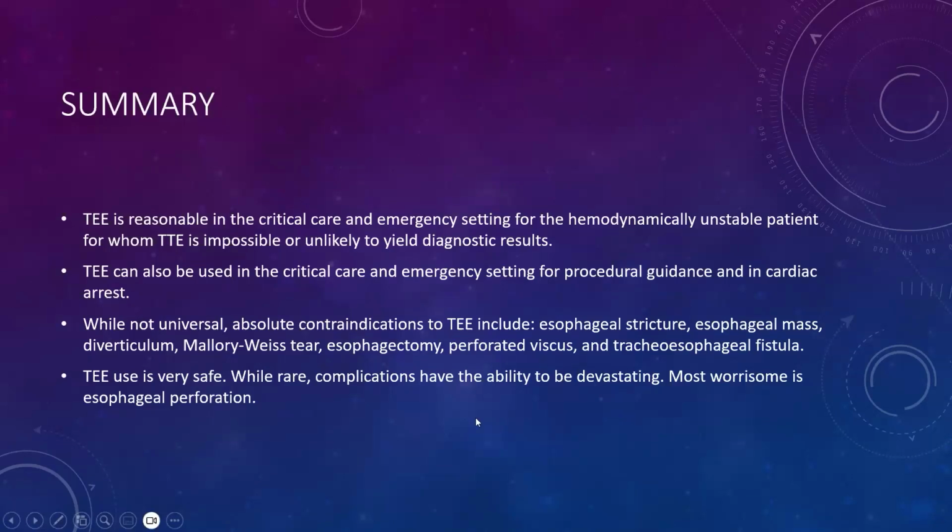There are problems with putting in TEE probes, right? The most devastating complication that we worry about is going to be esophageal perforation, right? And there are risk factors and contraindications to putting that probe in. So just be aware of those before you drop a probe.